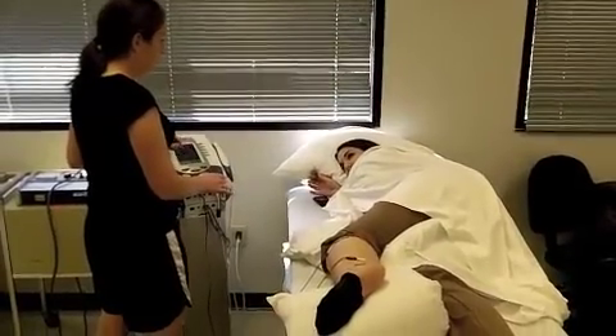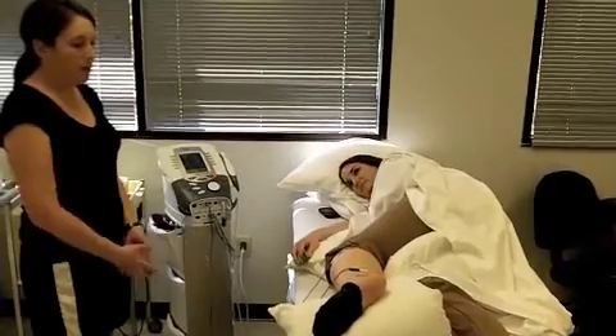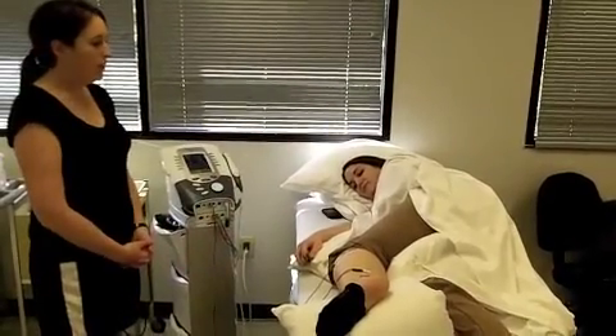What you're going to feel is a little bit of tingling, and you might have a little bit of a contraction. We want her leg propped up above the heart.